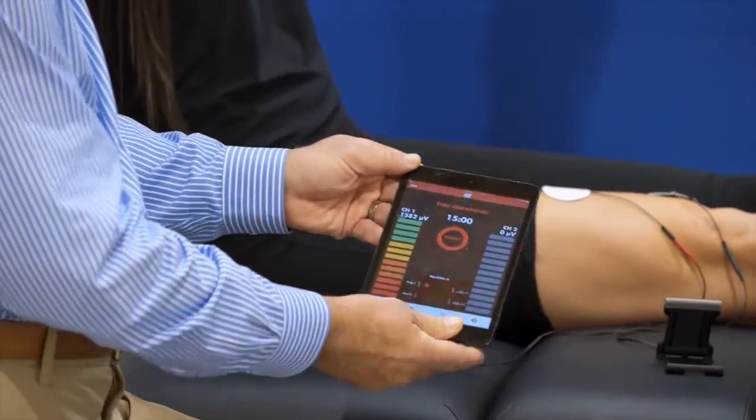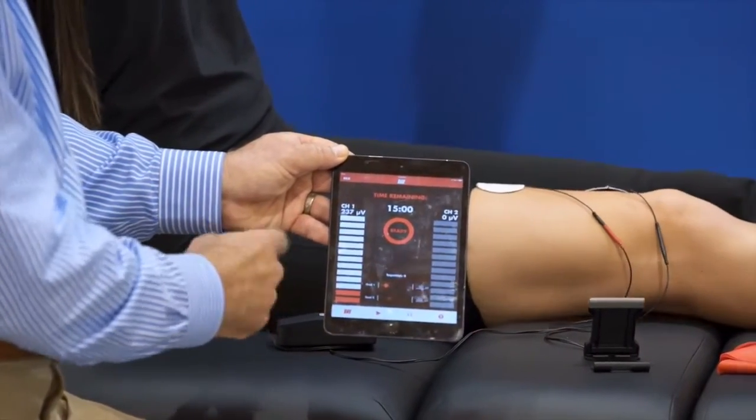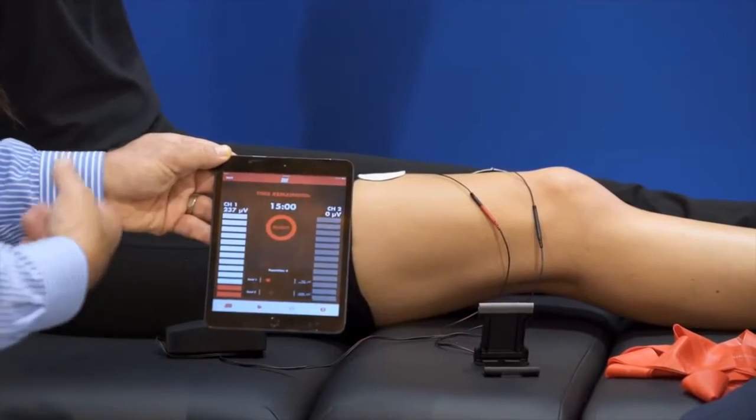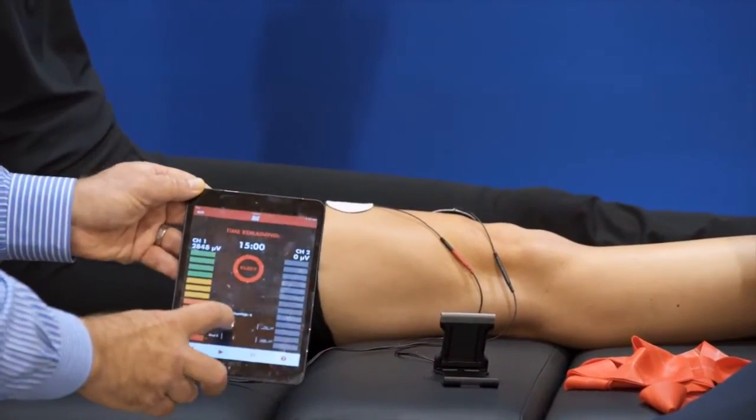Tighten your muscle up — squeeze really hard — you can see she's got a really good contraction. Now relax it. We set the on and off time to 10 seconds on, 10 seconds off, and we cycle that back and forth over a 10-minute period.